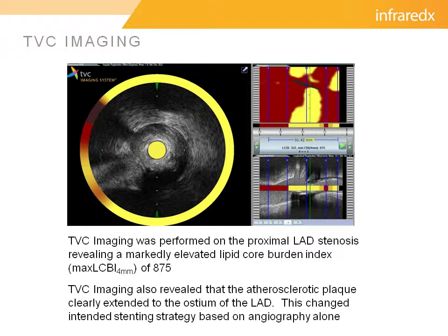Therefore, we decided to proceed with NIRS-IVUS, and this showed a very interesting result. As you can see in the bottom right-hand corner of the screen, the lesion has a very large plaque burden, and it extends all the way back into the left main. So our initial strategy was going to be to spot stent the severe lesion, but here, clearly by the NIRS-IVUS imaging, we know that the lesion extends back to the true ostium of the LAD and actually involves some of the left main.